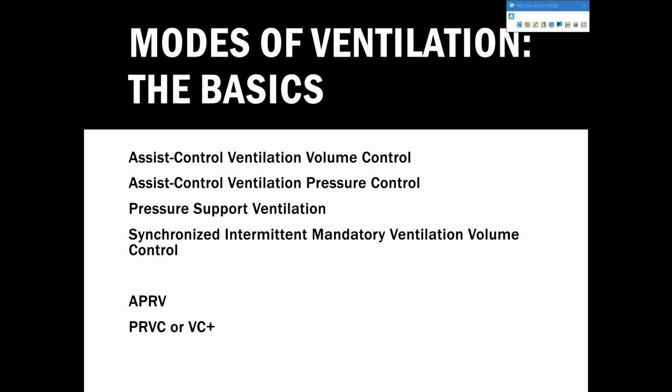So you set your patient up for 450 or whatever it is, and their peak pressures are 47, right? First thing you're going to do to figure out what's going on with that peak pressure is a plateau pressure, right? If the plateau pressure is 45, then that tells you it's not an airway issue. That means it is a poor compliance issue. So you have these crazy peak pressures and your compliance is horrible.